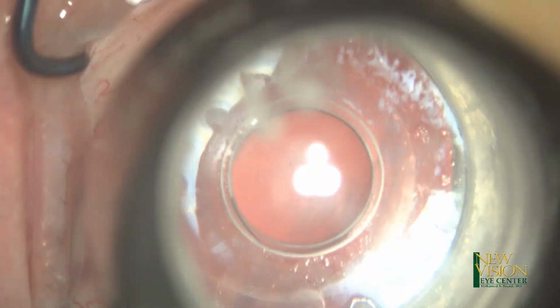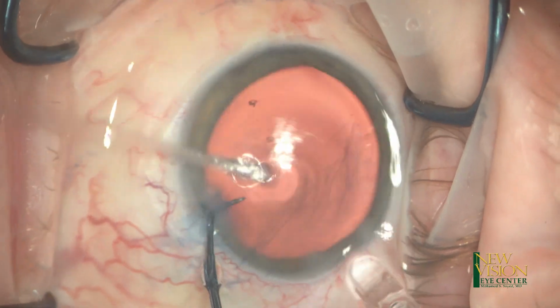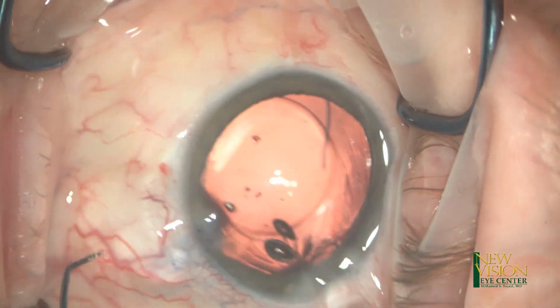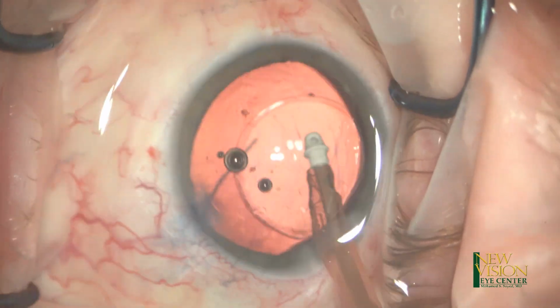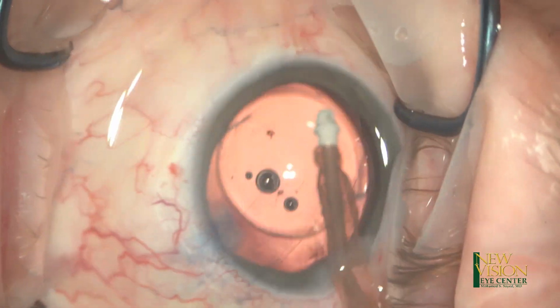I do the aberrometry, but there is no screen overlay, so we'll skip that part. But here comes the lens. I injected a 3-piece lens, and this is a silicone lens, and I know it pretty well. It's very slippery, and the moment you start doing the IA, it bounces around, but this was not the case.